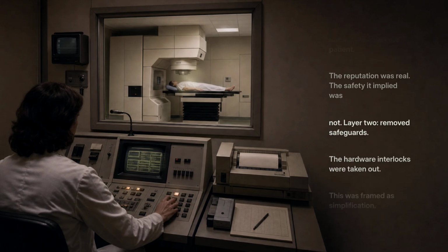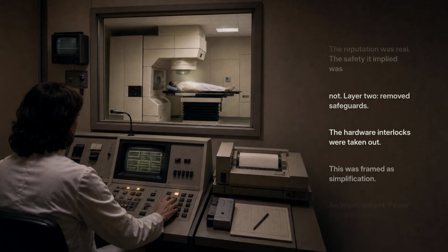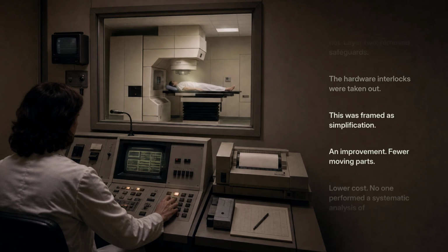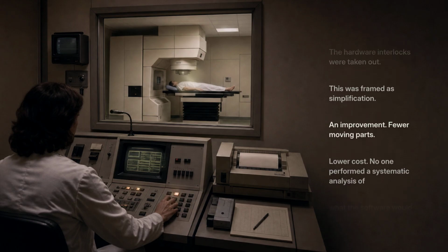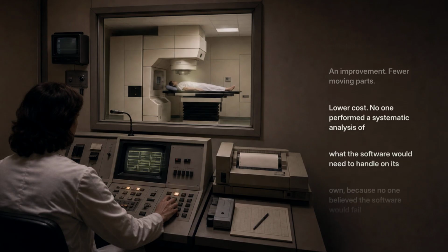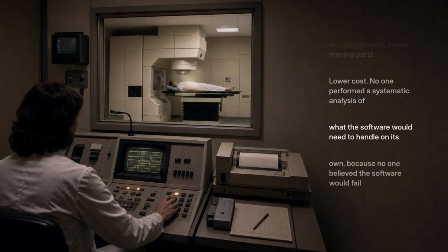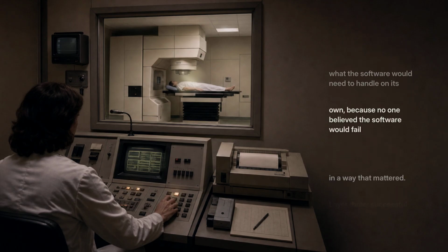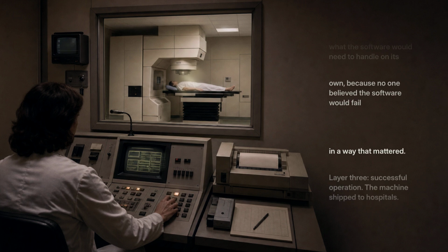Layer 2. Removed safeguards. The hardware interlocks were taken out. This was framed as simplification, an improvement, fewer moving parts, lower cost. No one performed a systematic analysis of what the software would need to handle on its own, because no one believed the software would fail in a way that mattered.